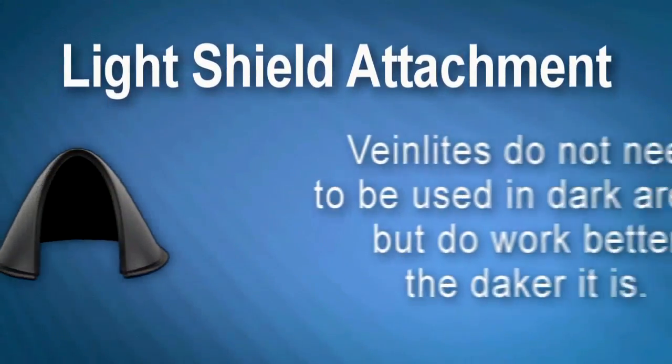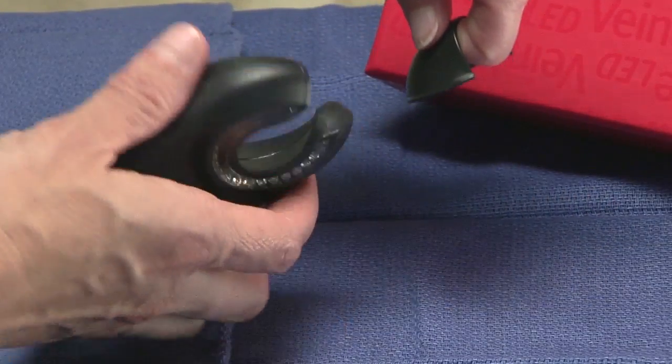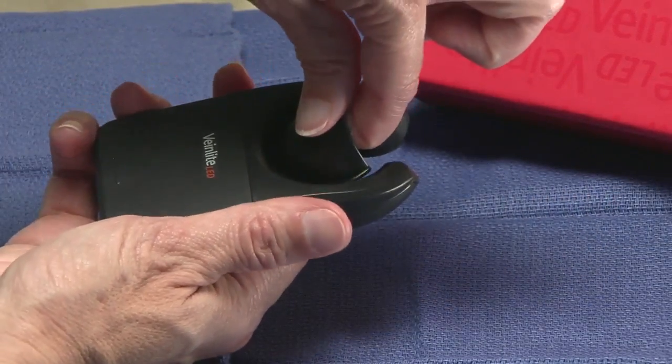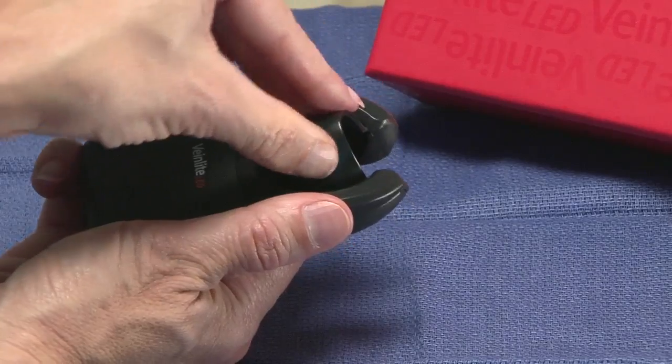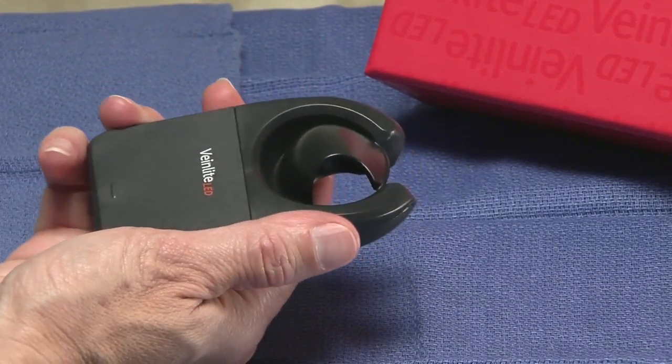Your VeinLight comes with a light shield. To apply this attachment, place it on the opposite side of the LEDs in the vein imaging area. This attachment swivels 360 degrees, allowing optimal viewing when scanning for the vein.